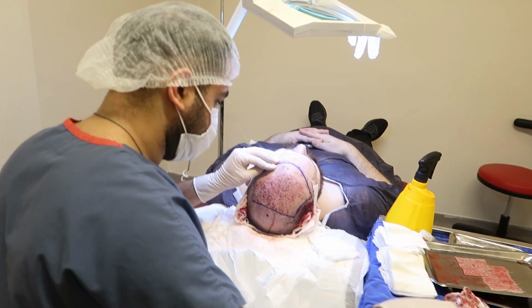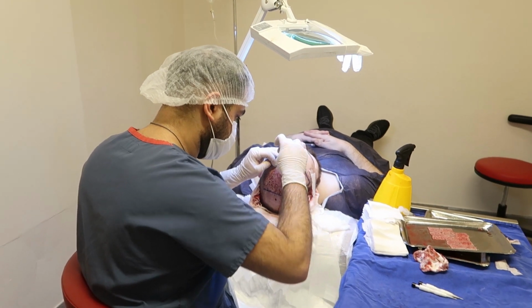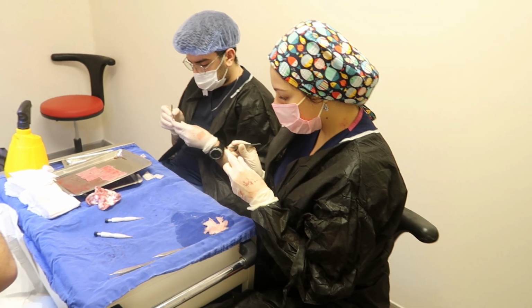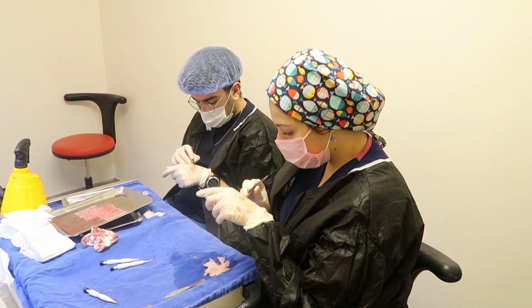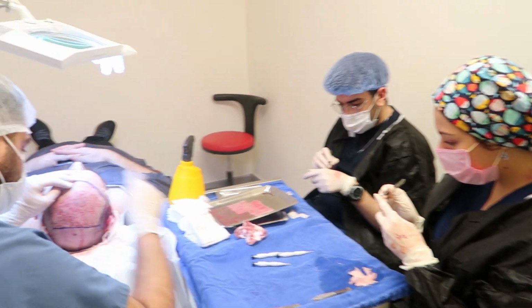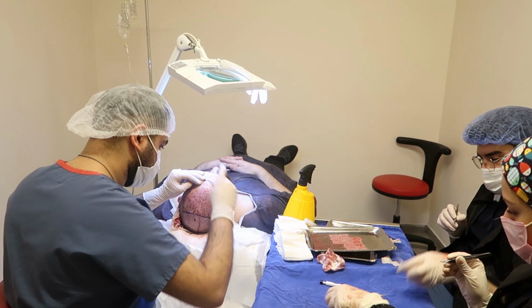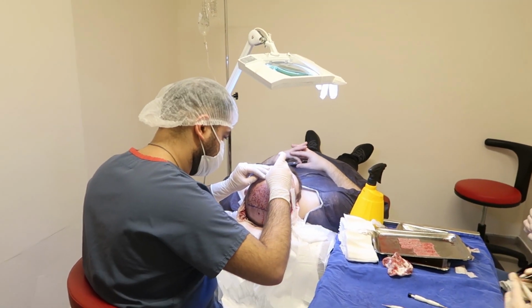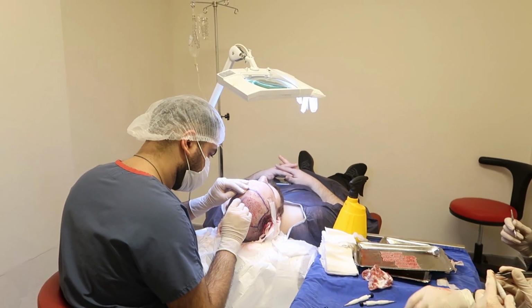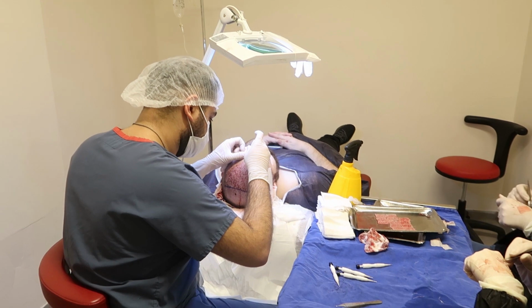So there's 3 people here. The doctor is using these little pens to implant the little hairs in, and these people are working really fast. They're putting those little hairs in the pens so that the doctor can be quick. It's been like 2 or 3 more hours already, I don't even know. And they said it's another 40 minutes? Maybe half hour. Okay, so I asked a half hour ago.